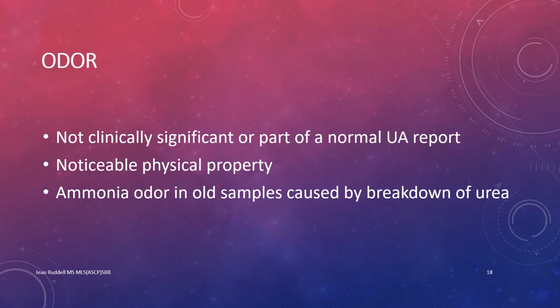Odor. While odor is not normally part of a urinalysis exam, it is a noticeable physical property. Normal urine has a faint aromatic smell, and older samples will smell like ammonia due to the breakdown of urea.